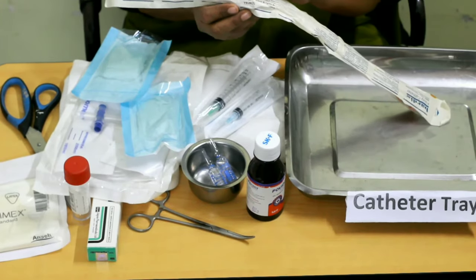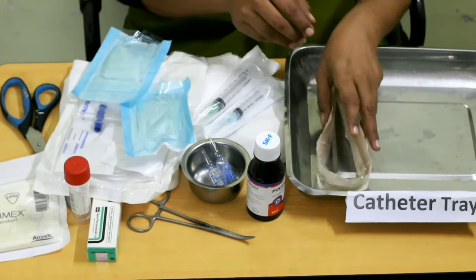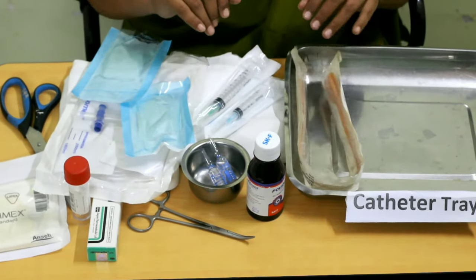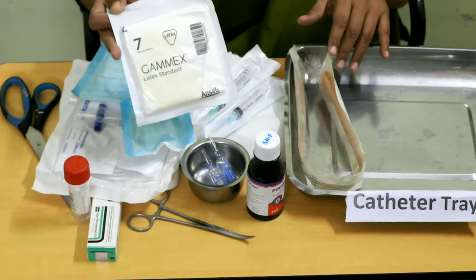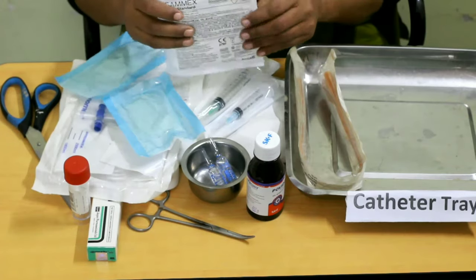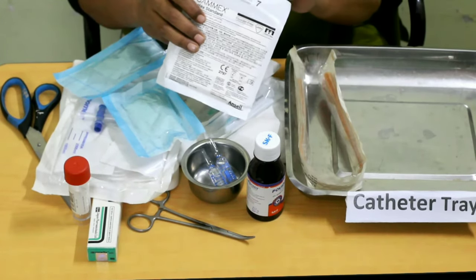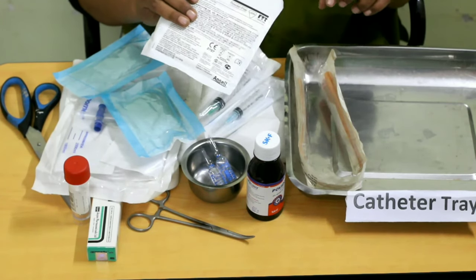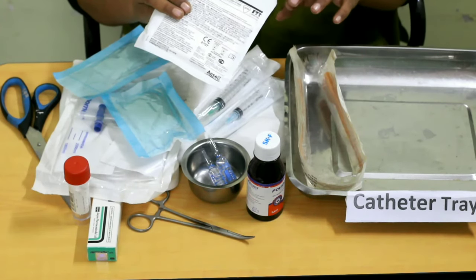These are the draping sheets — leggings. We are putting out the draping sheets in this way. We are wearing gloves — sterile gloves. When we are wearing the draping we will wear gloves. It is important for experts to wear gloves.